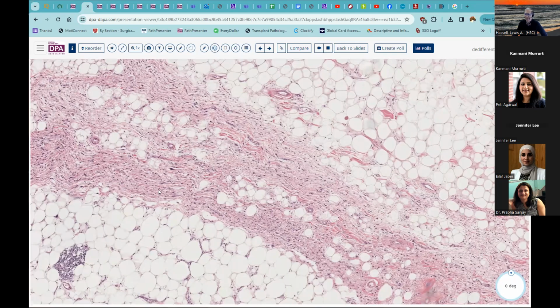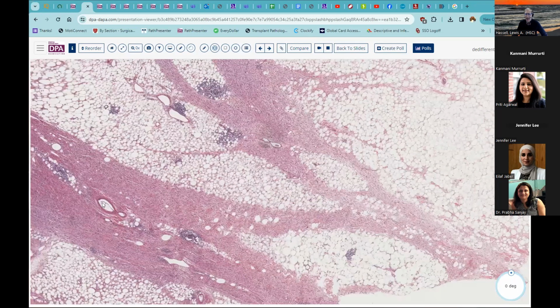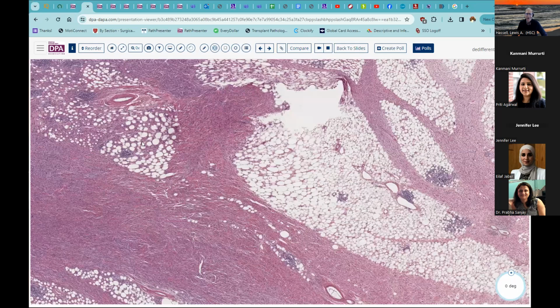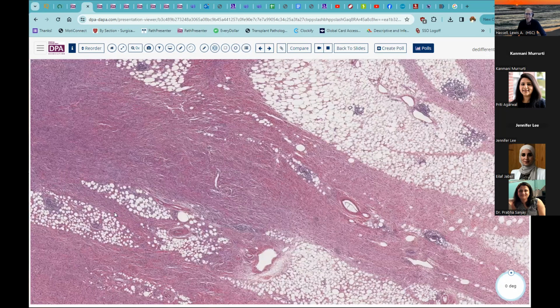I'm not a mainstream soft tissue pathologist necessarily, but I think in terms of thinking about how this tumor develops, how it grows and spreads, this pattern of infiltrative growth around the pre-existing fat is much more characteristic of the growth patterns of non-lipogenic tumors like dermatofibrosarcoma protuberans, like pleomorphic hyalinizing angiectatic tumor, these other things we've just looked at that have sometimes also this engulfing and permeative pattern around pre-existing fat until it obliterates the fat.